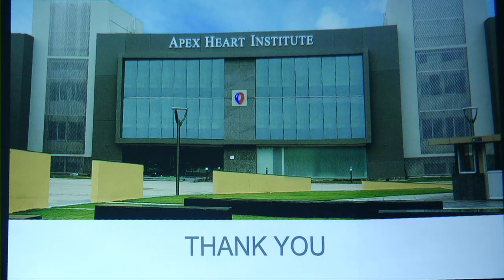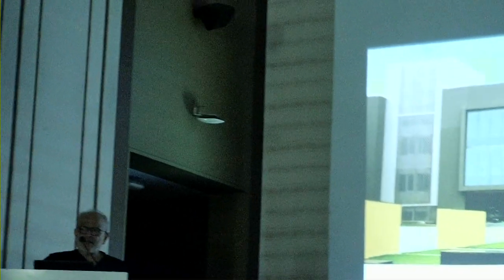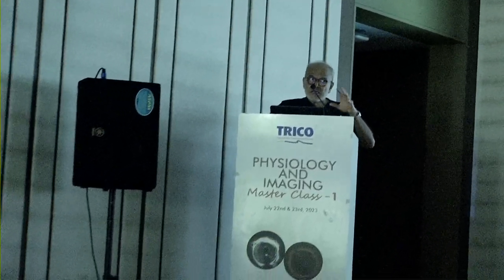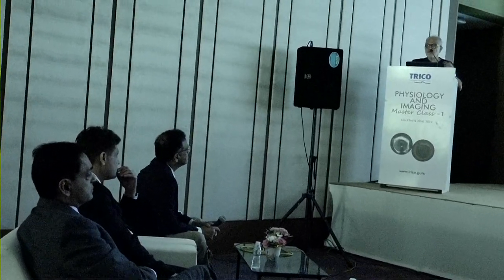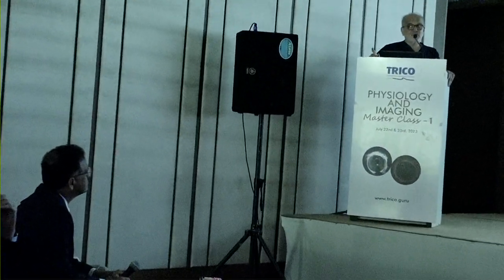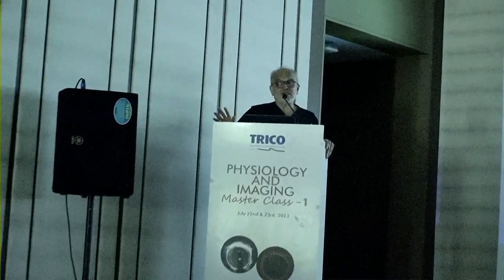What do you think, as far as the incremental value of OCT over IVUS? I think tissue characterization, OCT scores over IVUS. Looking at the big artery lumen, IVUS scores over OCT. If I want to work on the left main ostium, I will not think of OCT, I will think only of IVUS. If I have to work on the left main bifurcation, where the size is less than 4.5, I will use OCT. And in other areas accordingly.